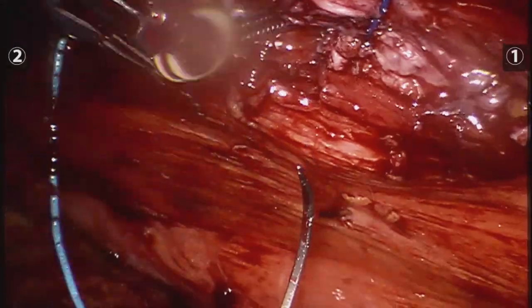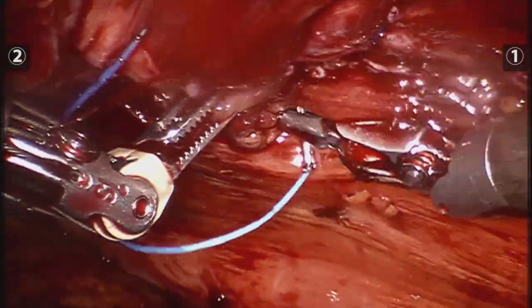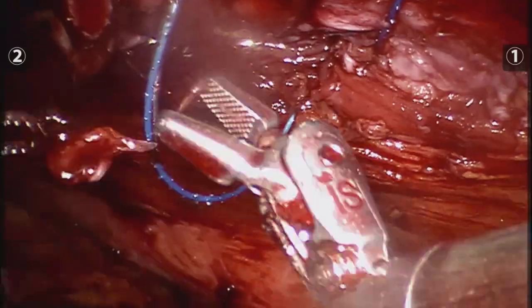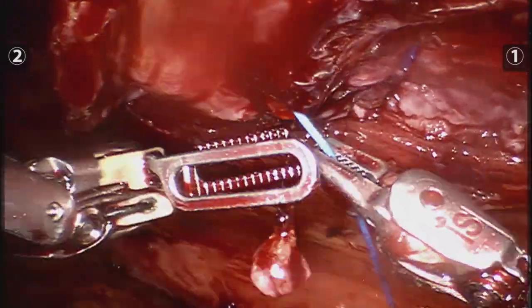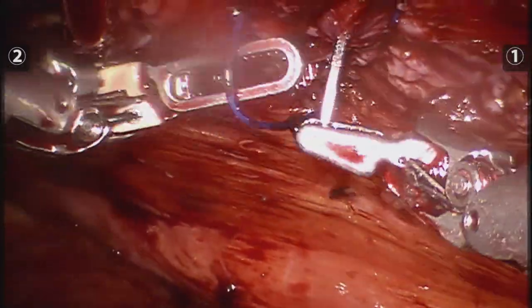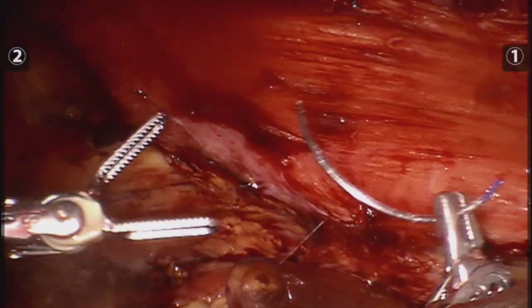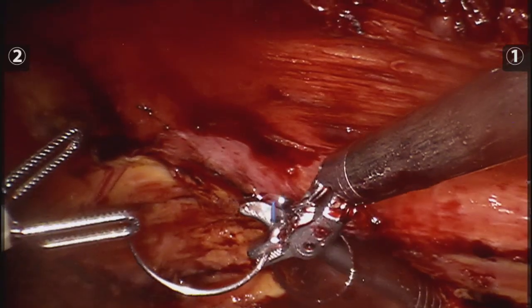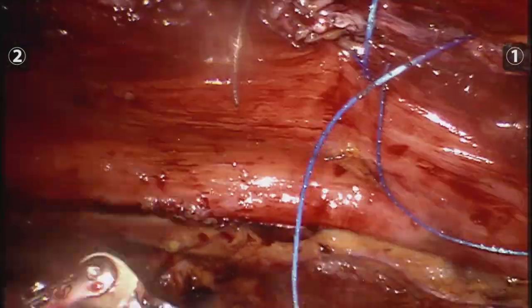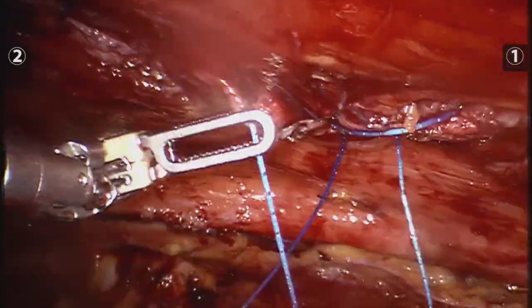I also want to make a comment about Dr. Luis Alfonso Martín del Campo, who was my assistant during this first procedure. He is a wonderful surgeon with lots of experience in robotic surgery and a very important part of making this happen. Then the last part was to close the defect on the suprapubic region — once the bigger defect came together, this was a lot easier to close.